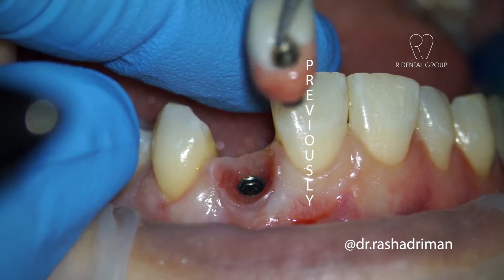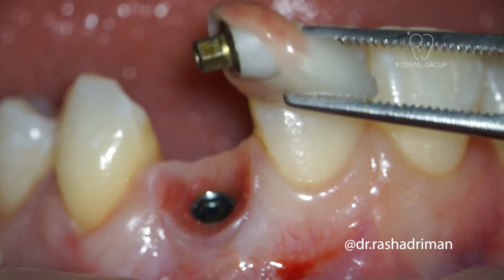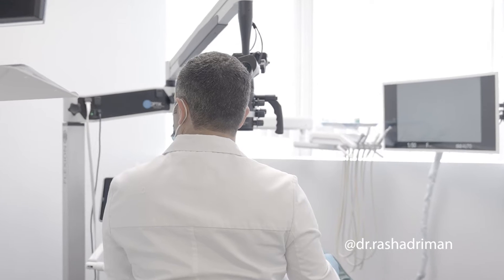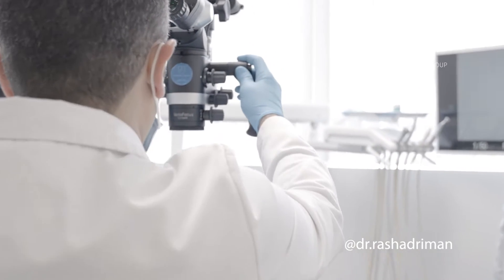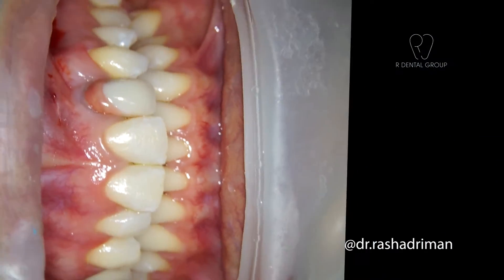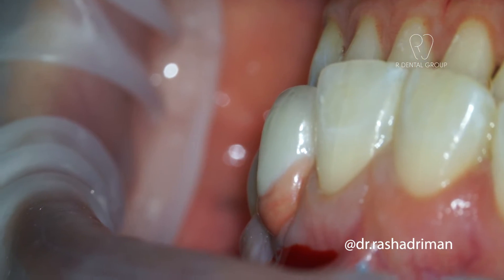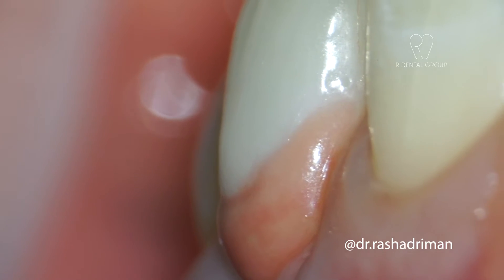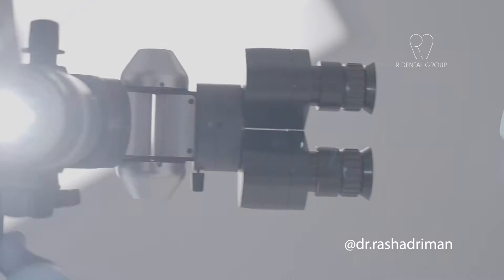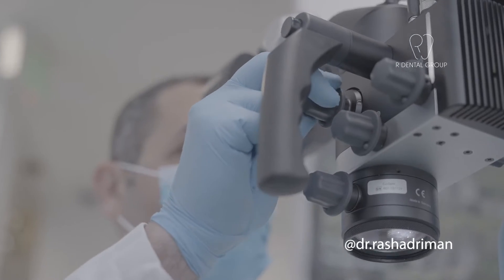Previously on this case, I showed you how I removed the existing bulky implant crown. In this video, I'm going to show you how I connect the impression coping. This is a recap to show you that this is a bulky implant crown that's totally throwing off this patient's smile harmony. So we need to remove it and either fabricate a new crown, remove the implant and place a new implant, or a Maryland bridge.